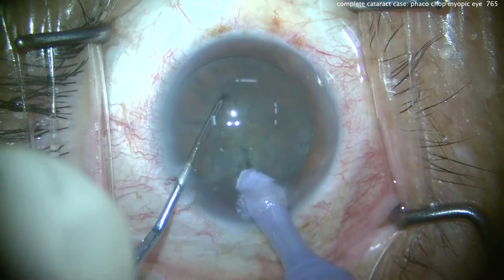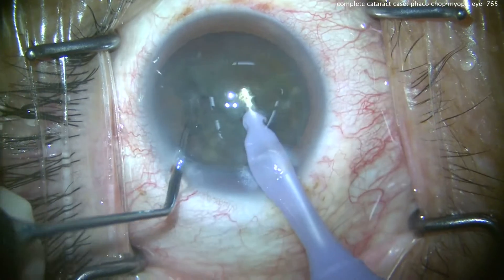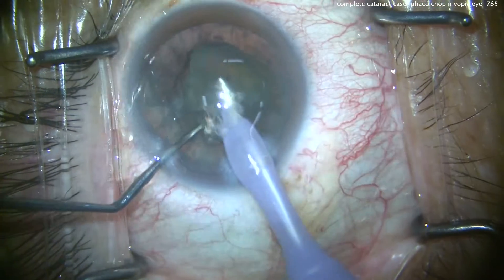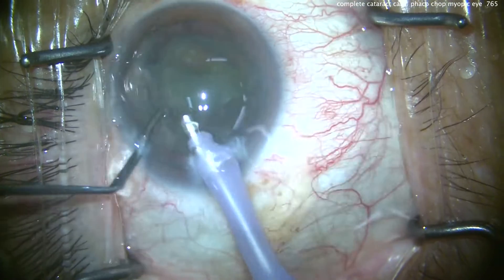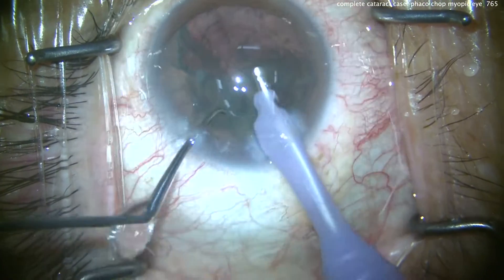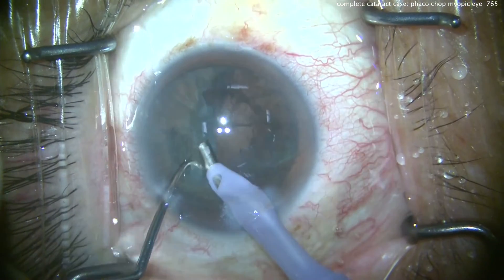There's the chopper. Buzz into the nucleus — let's split this into two halves. Taking our time to really fully separate those halves. We'll bring up each half one by one into the iris plane, where we can easily emulsify it. Notice how we're just using the chopper to keep the lens pieces right in front of the tip.